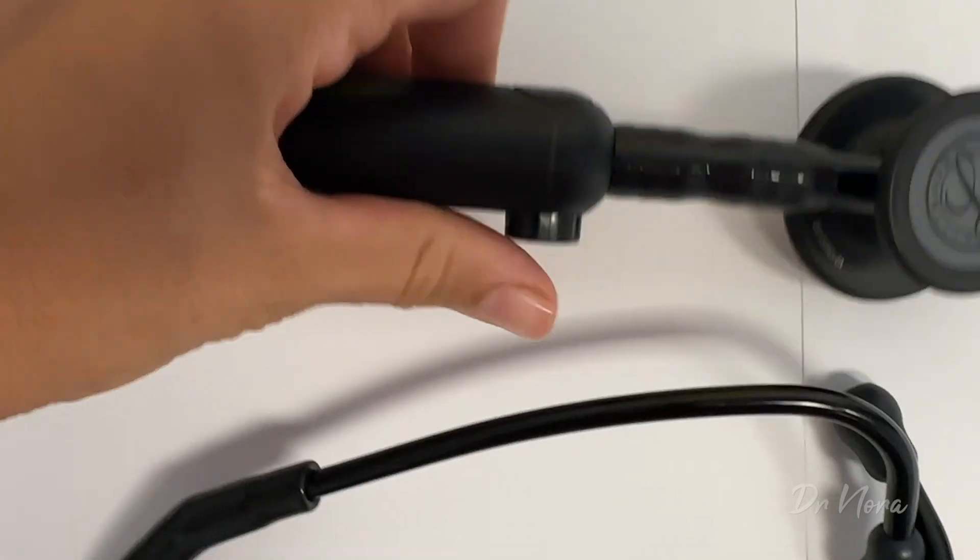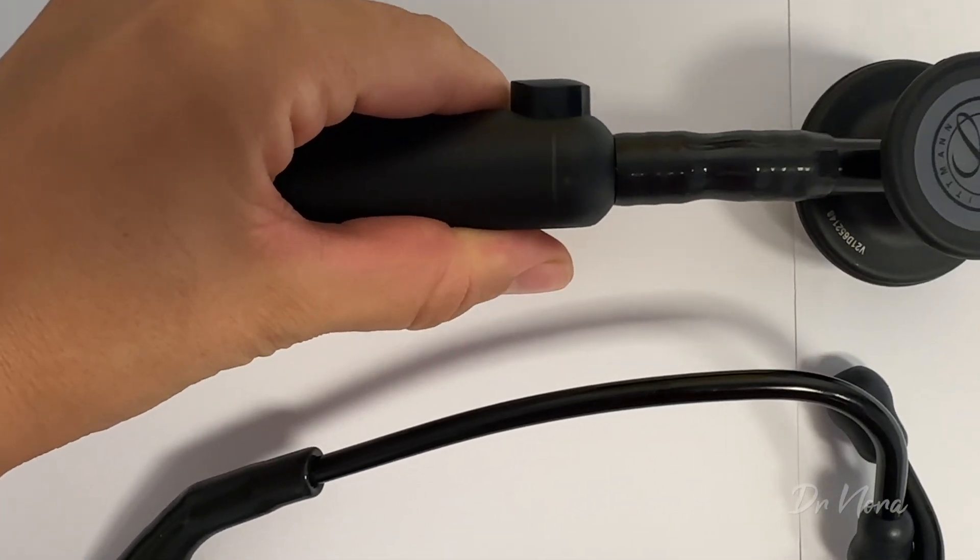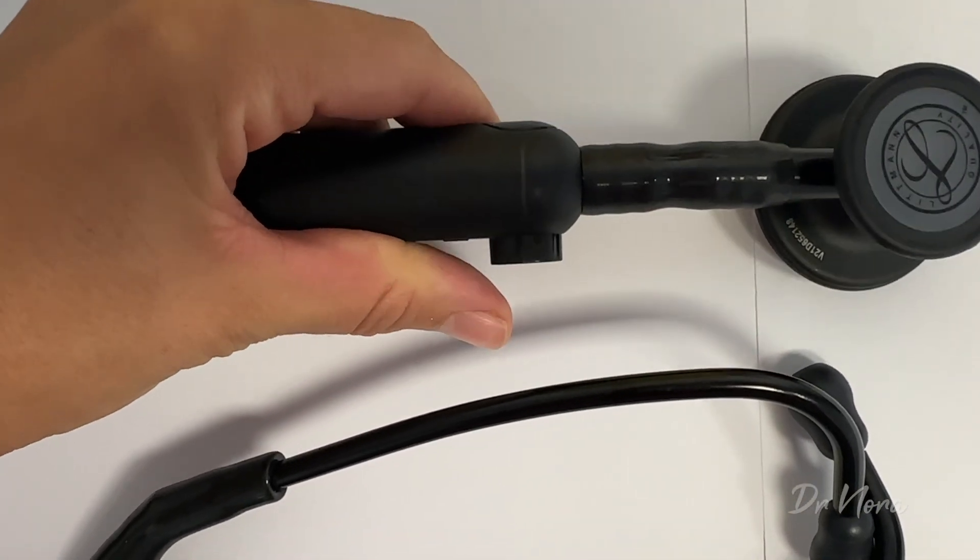One thing that happened a few times during testing is that I did accidentally press the toggle button while auscultating the patient. This could be because I'm just not used to it, or it could be that when you're moving the stethoscope from one valve placement to another and your hand is over the toggle, it's really easy to accidentally press it. This became a bit of a shock — suddenly it would go from really loud to really quiet. I learned my lesson quickly to keep my hand away from the toggle, otherwise you go from digital to analog and you just can't hear it very well.